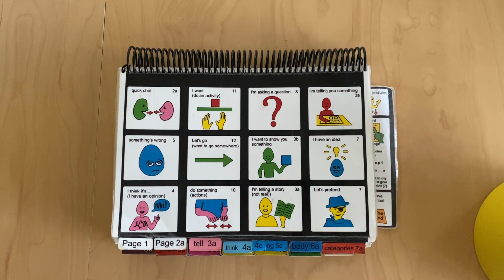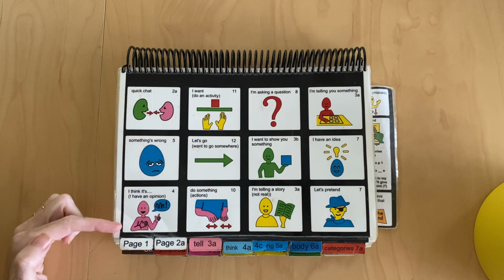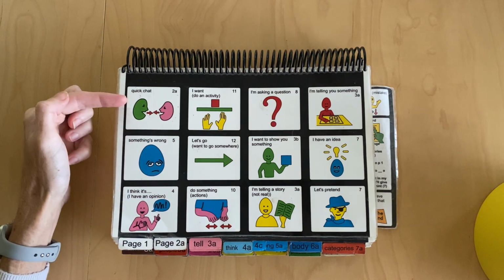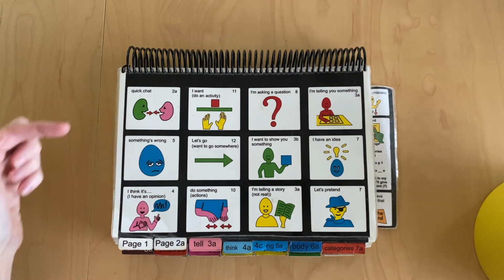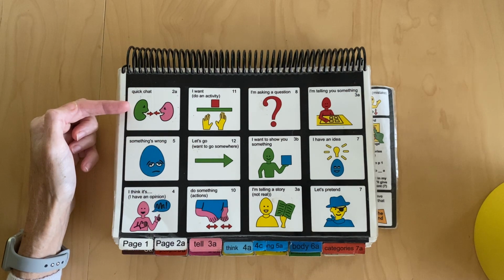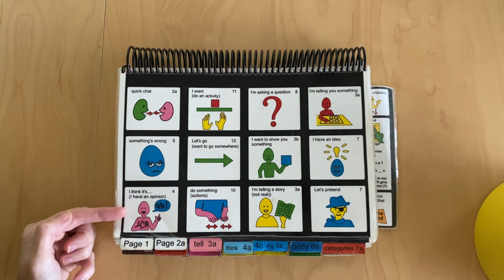So if I had something to say, or if Angela had something to say, she would raise her hand. I would say, oh, your hand is raised, you have something to say. And I would begin scanning. I scan each column one at a time. Quick chat, something's wrong, I think it's. If she says yes, then I scan each one individually. Quick chat, something's wrong, I think it's. Yes, she says yes to I think it's.